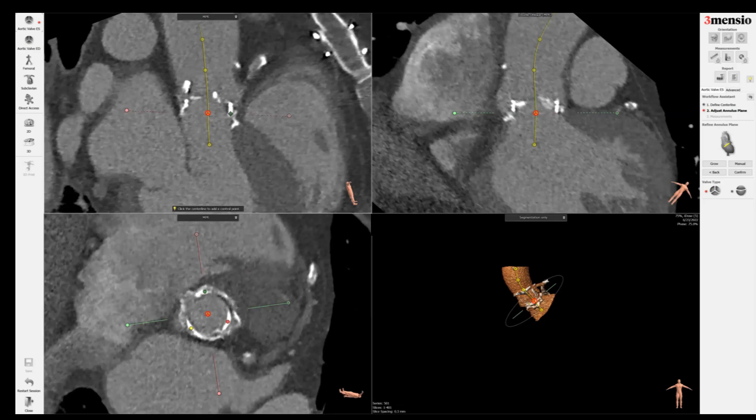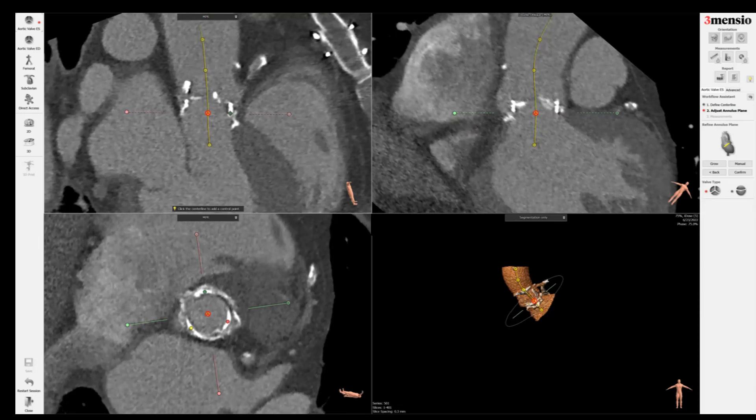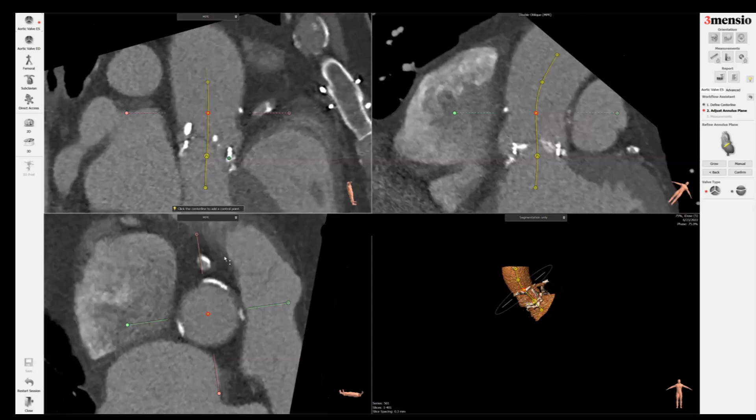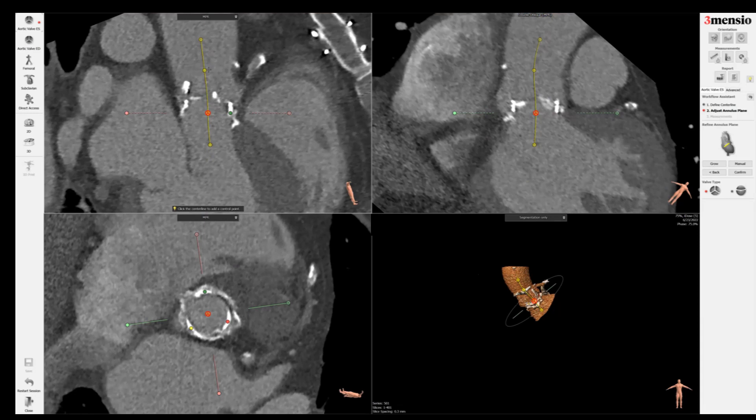Sometimes these valves get distorted — they might be canted from the aortic root, so you might not be exactly at the bottom and it might not be symmetric. Now we have to make sure this is a centerline. Because it's valve-in-valve TAVR, sometimes the surgical valve may be canted.